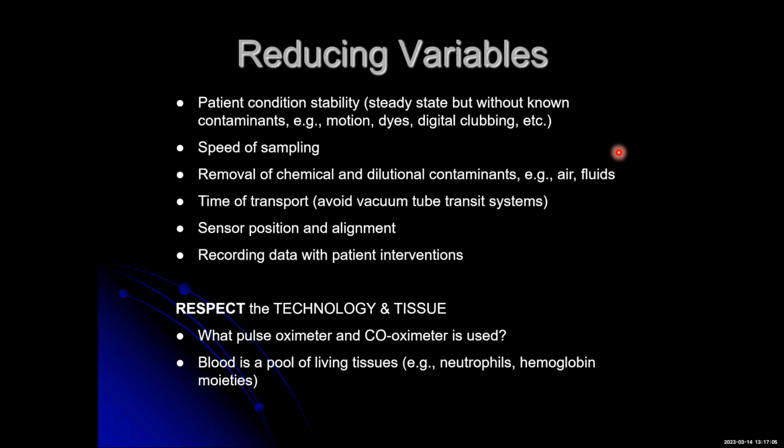That's an AAP standard. And we also have this for screening for congenital heart defects. But there's plenty of other examples of what happens in an emergency department and whether or not a person's going to get a nasal cannula. So those kind of clinical guidelines we don't have control for, but we should be able to educate the clinicians that are writing such guidelines to warn them of the shortcomings of the technology.